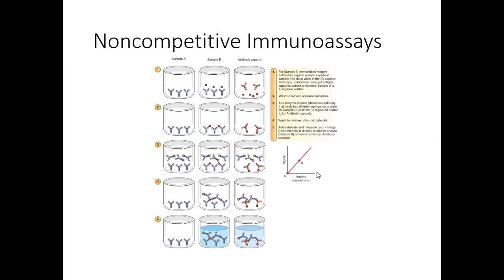The antibody capture that we see, the third column here, is really an illustration, the same as we just saw in the indirect assay. Immobilized antigen is used in order to look for antibody in the patient serum. If it's present, the antigen captures the antibody, binds to it here. So we had immobilized antigen, add patient sample that maybe contains the antibody we look for. If it does, it creates a complex. So we have a step that could potentially complex. So what do we do? We rinse, we wash, then we add the labeled anti-human antiglobulin. So remember, this is not matching to the antigen, but this is going to tag to the Fc region of this patient's antibody. And if that happens, we just created a complex of antigen, patient antibody, tagged antibody.